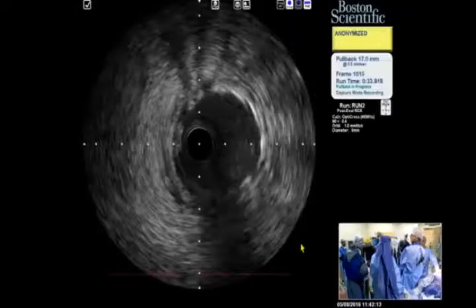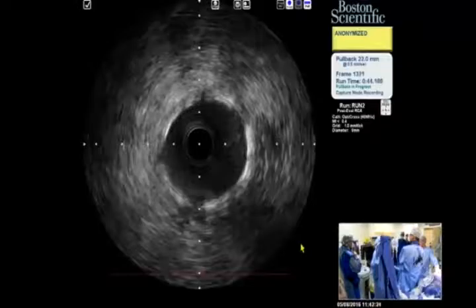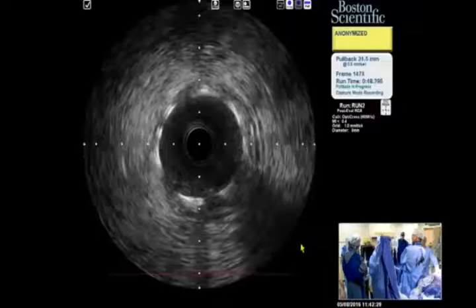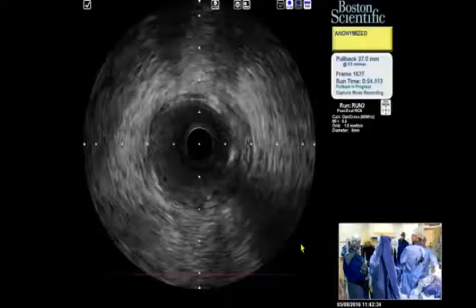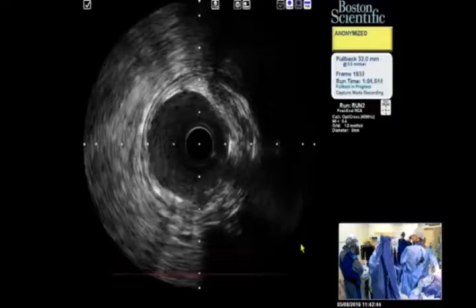The stent is coming. Image. It's a well-expanded stent. You can just see the stent close to the vessel wall. Can you see IVUS? No, you cannot see IVUS. What is the thickness of this stent, Strat? 65. Well expanded.